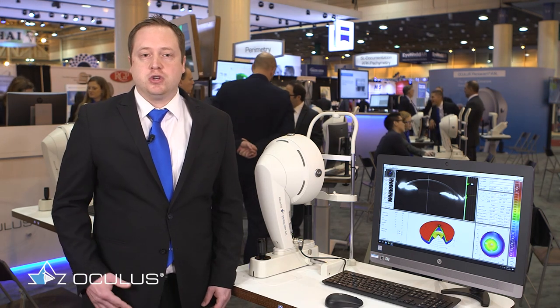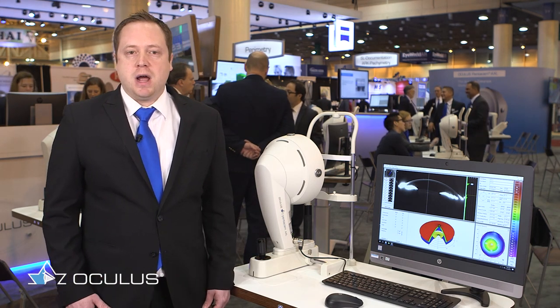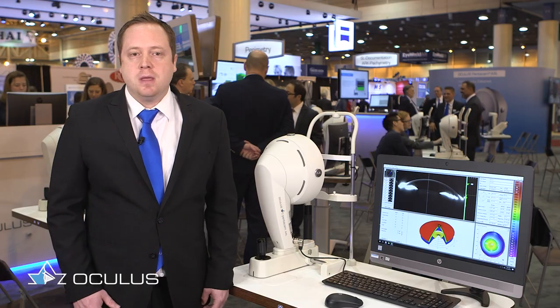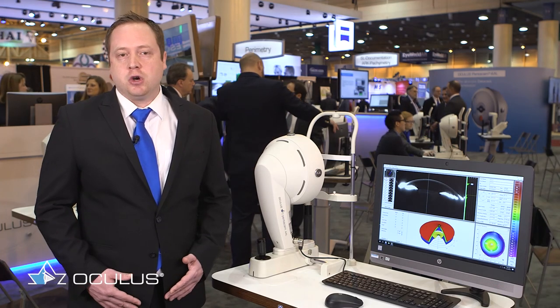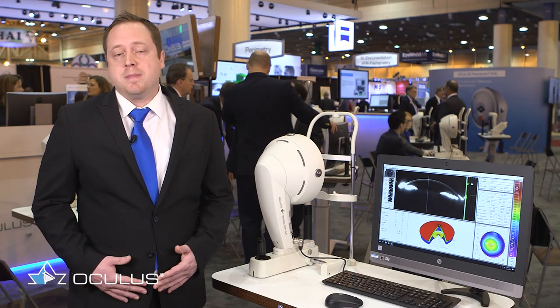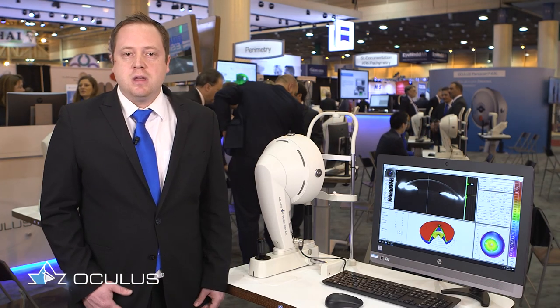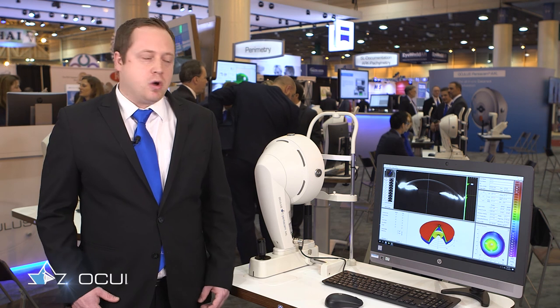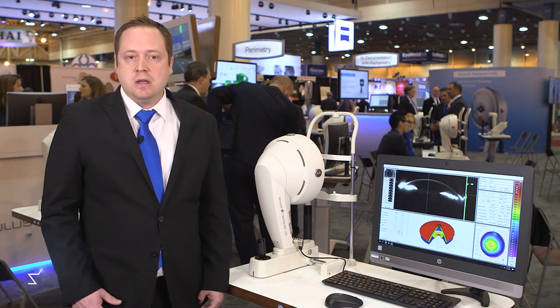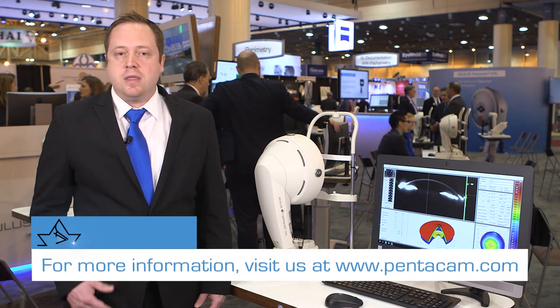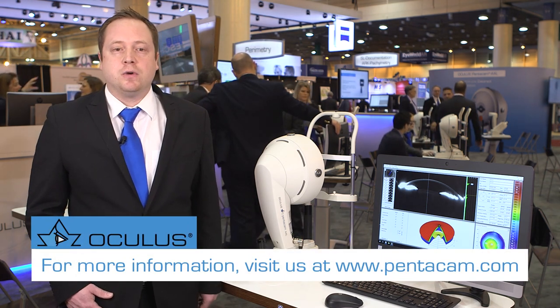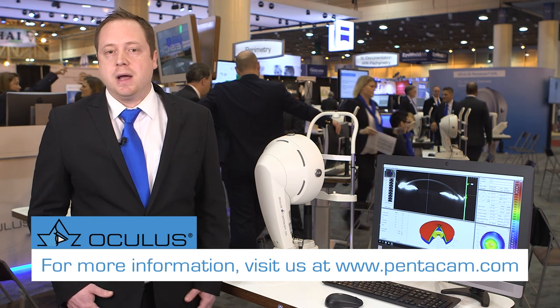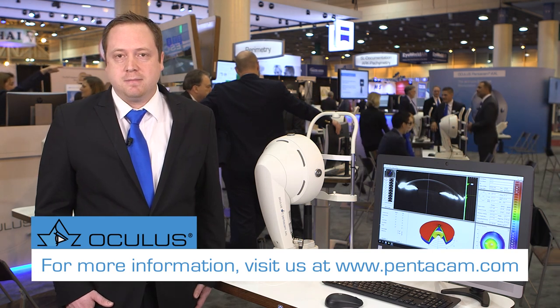So as you can see the Pentacam AXL gives us a lot of good information for general screening, screening for refractive surgery, management of keratoconus, and preoperative evaluation for cataract surgery to help determine what the best lens design for the patient is. Also we can go one step further with the AXL and do the IOL calculations themselves for any type of eye. Thank you for listening and have a great day.